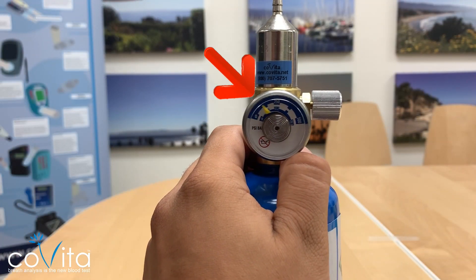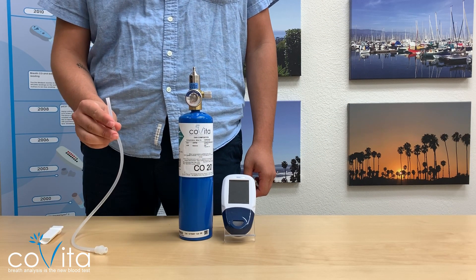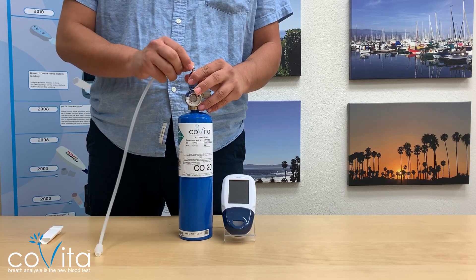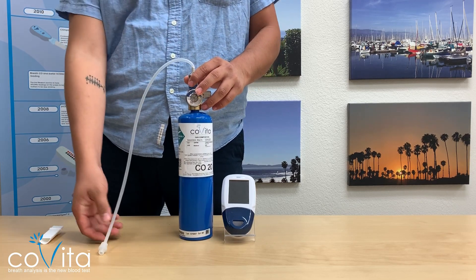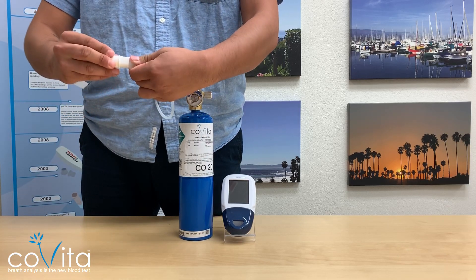Once this is done, verify the gauge on the regulator flow meter is registering gas. Attach the small end of the Cali adapter tubing into the regulator flow meter. Insert the larger end of the Cali adapter tubing into the round hole of the D-piece.